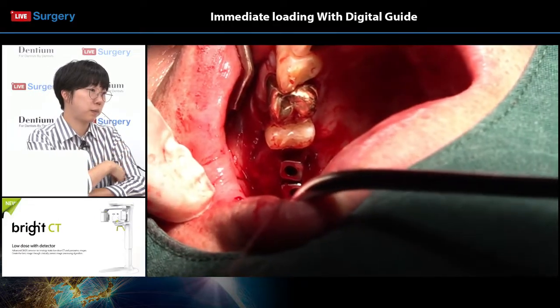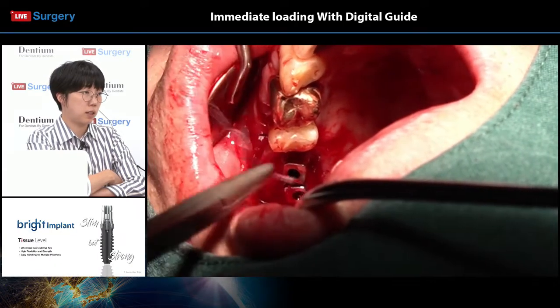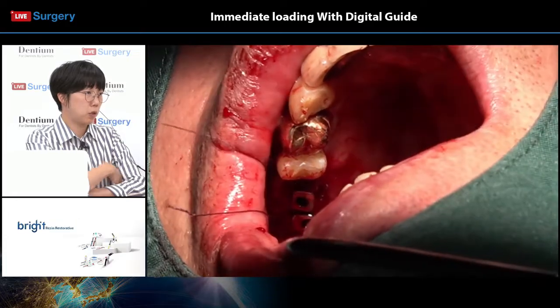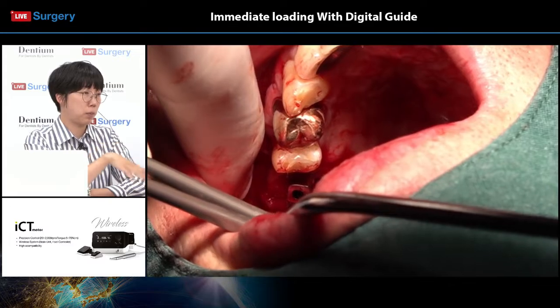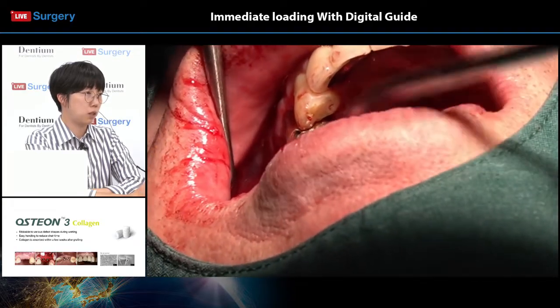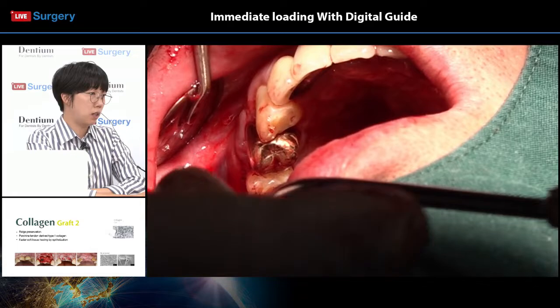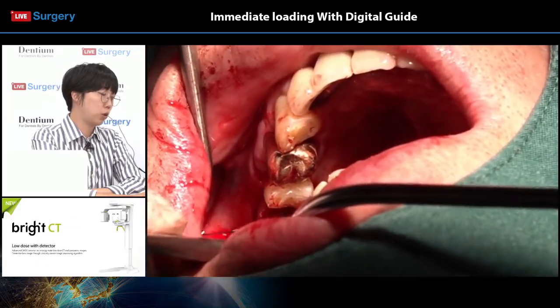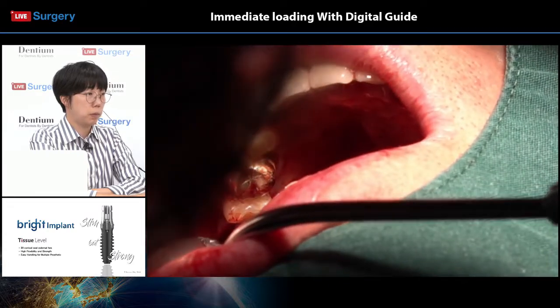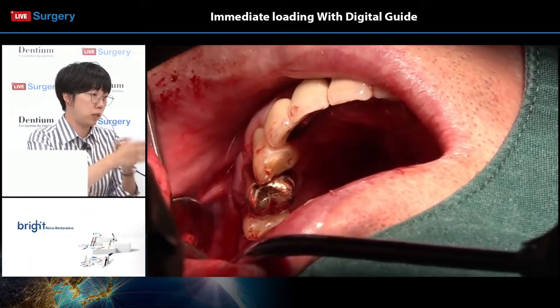Even in cases where there is a lot of bleeding, it's always very satisfactory for the dentist or surgeon to see that the bleeding ceases when a clean suture is done. So the surgery and the grafting procedure and the membrane placement, all this is very important, but to make sure that your surgery has a good outcome, it is always great to check your sutures and to make sure that your flaps are positioned in an ideal position where you can have primary closure with minimal tension in the area. Or in an open healing case, you still want your flaps to be in a position that you want them to be and not be folded into some place.